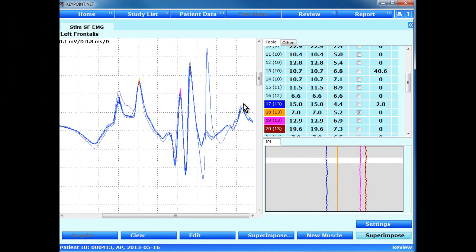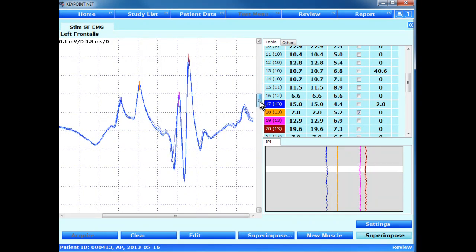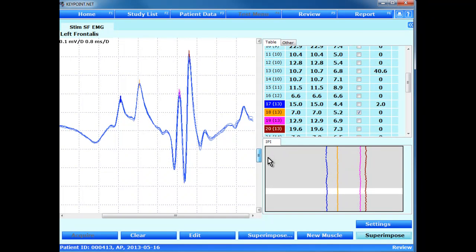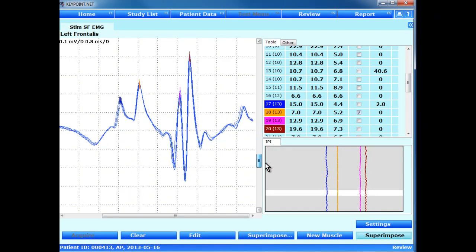This one is also not measured, and these two belong to the same trace stimulated from the same axon. And this last component here is moving back and forth, and it's definitely not a clean signal. The movement here is not due to electrode movements, because then all of them should have been moving in parallel. So this recording is accepted with 4 components.